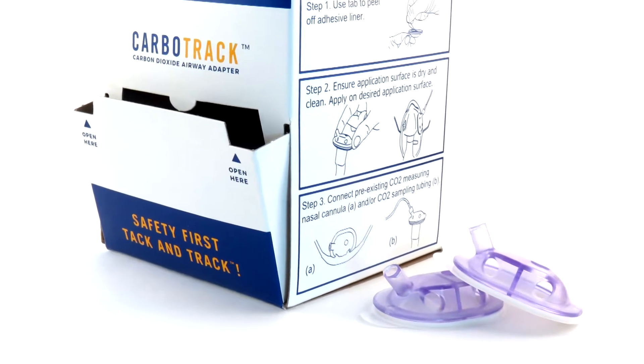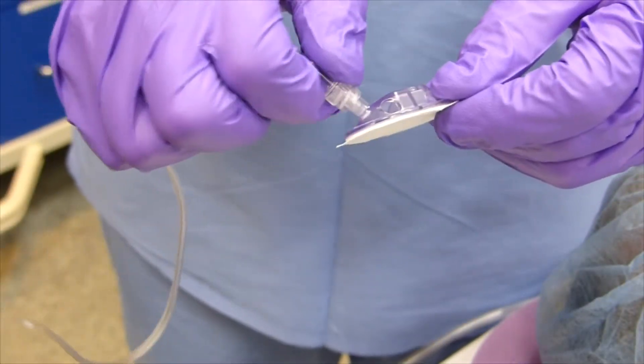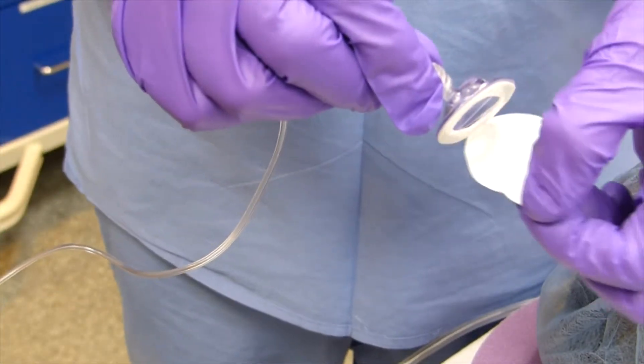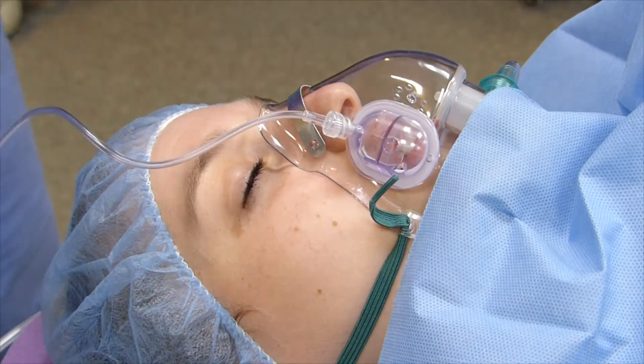We're entering our data manually, so it's nice to have the Carbotrack for its reliability with the tracing. It's really easy to use. You peel off the back, apply it, and it adheres well. The adhesive is good enough that if you need to switch to a different airway or a different mask, it'll still have enough adhesion to stick a second time. You pop it on, there are ports for nasal cannula to fit into it, and you connect your CO2.